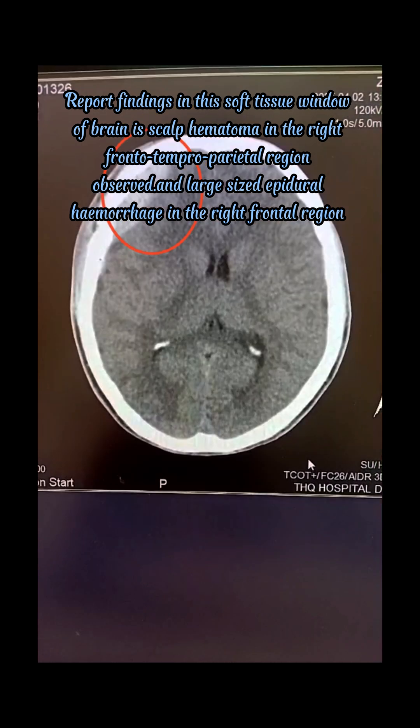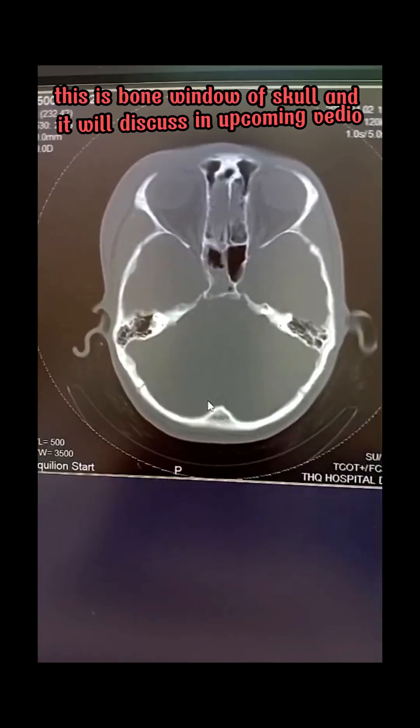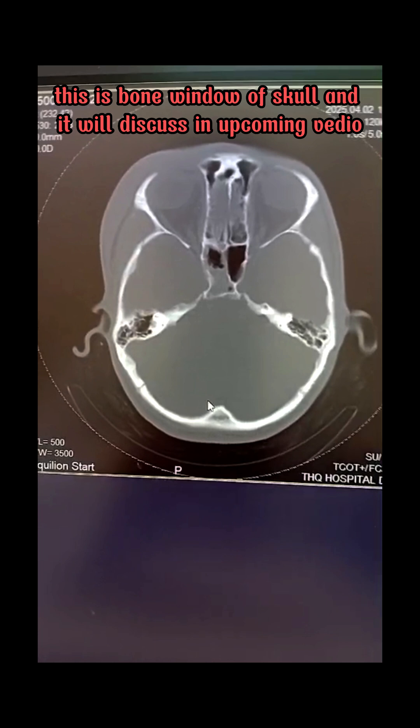And large-sized epidural hemorrhage in the right frontal region. This is the end of the axial soft tissue window of the brain. The bone window of the skull will be discussed in the upcoming video.